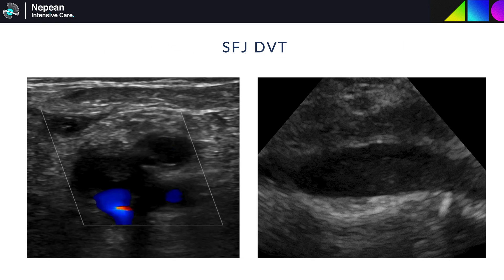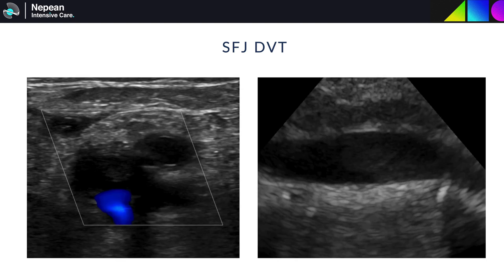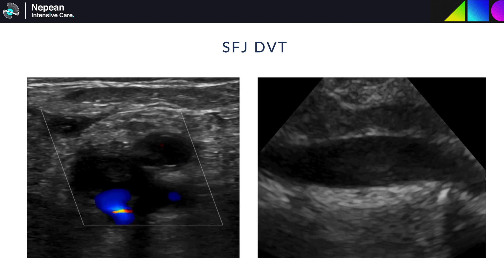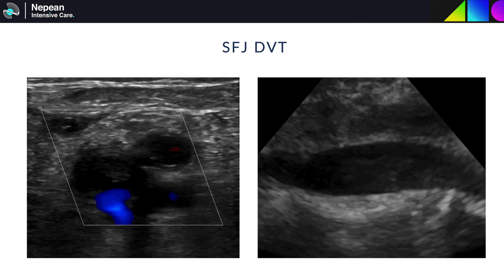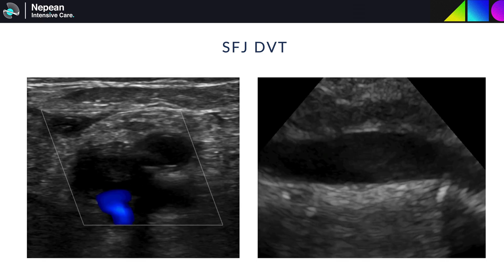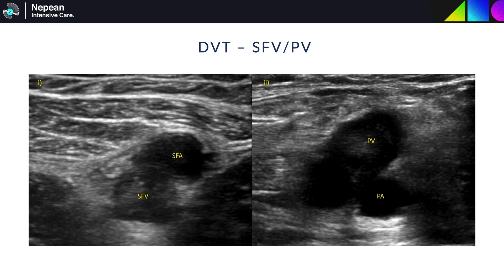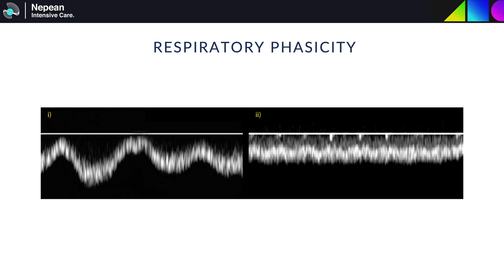DVTs are seen either as a filling defect or an echogenic, often mobile, structure within the vein. This is an example of a DVT within the common femoral vein seen in both short and long axes. These are both examples of thrombus within the superficial femoral vein and the popliteal vein. Scanning this region has the potential to miss thrombus both proximal and distal to the flow of blood. Certain additional tests can be used to predict the risk of thrombus more peripheral than the popliteal trifurcation or more central than the femoral vein.